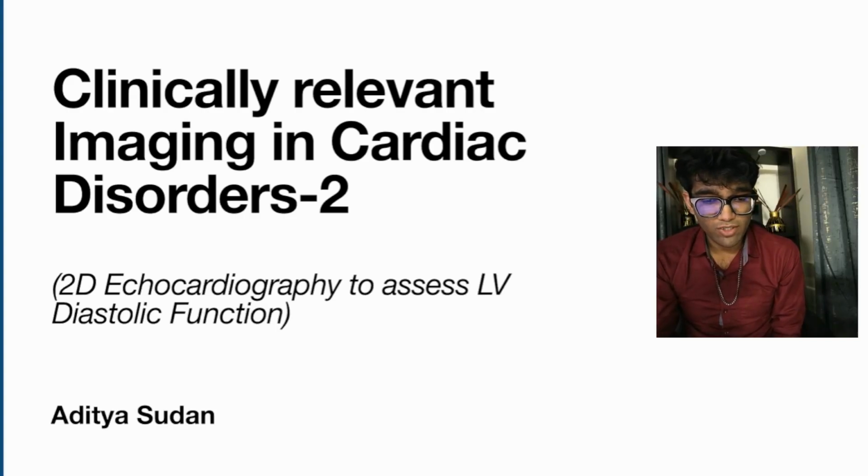Welcome back. Today we'll be talking about cardiac imaging. Specifically, we'll be talking about 2D echocardiography to assess LV diastolic dysfunction.